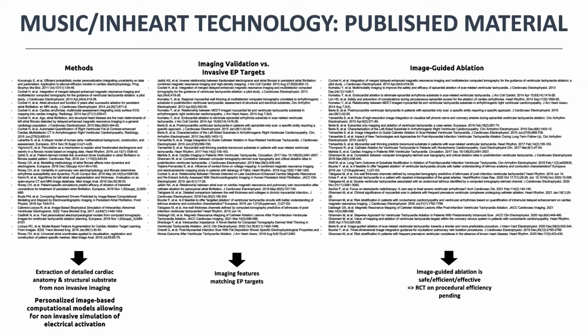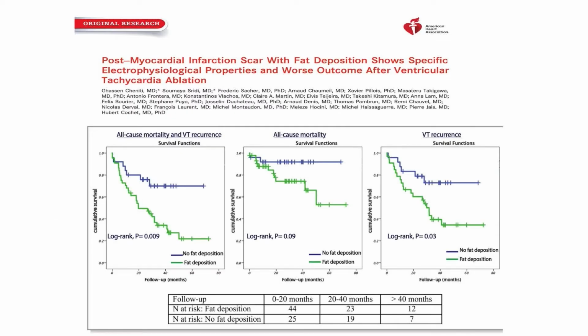And then image-guided ablation was also used. It could be phrased as image-aided when you do not import and merge the 3D reconstructed model of your patient into your navigation system, or guided when you do so, which is of course the best way to proceed.